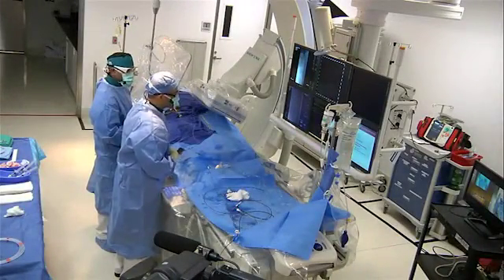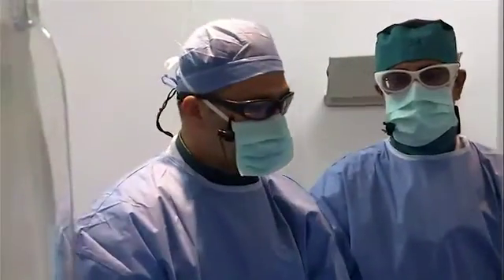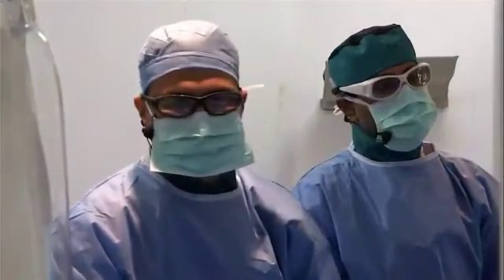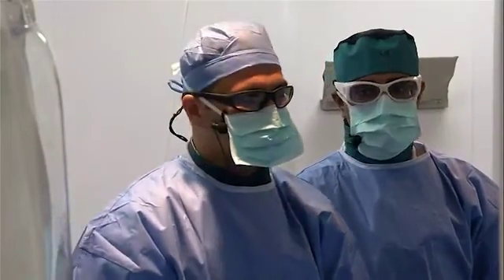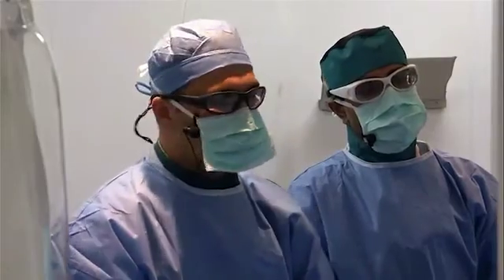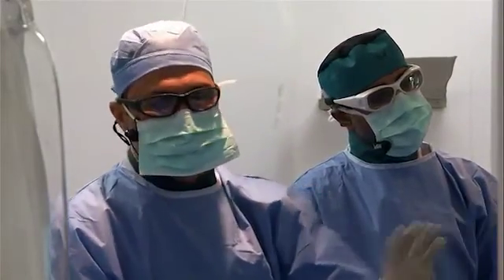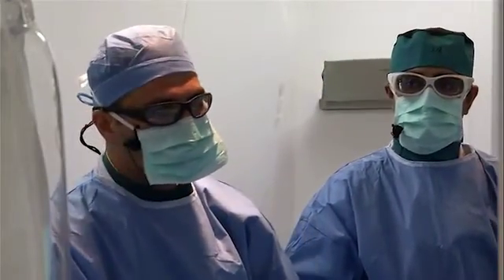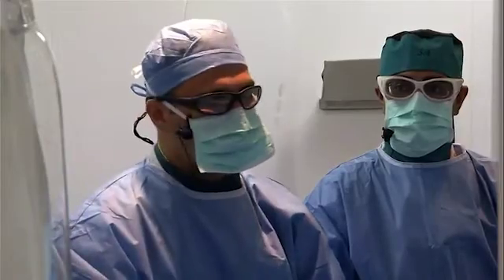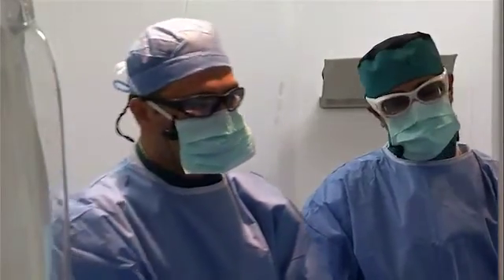We did discuss the case as to what the best approach would be for this patient. Given her comorbidities and this extensive edema, I felt that an endovascular approach may not be unreasonable, because the occlusion itself is very short, and I will show you better pictures now so you can see the occlusion. The main issue is the fistulas and how to deal with them, and I am not sure a bypass would deal with that or not, so I'd be interested in what the panel thinks.